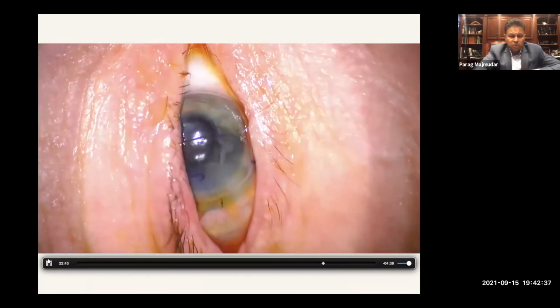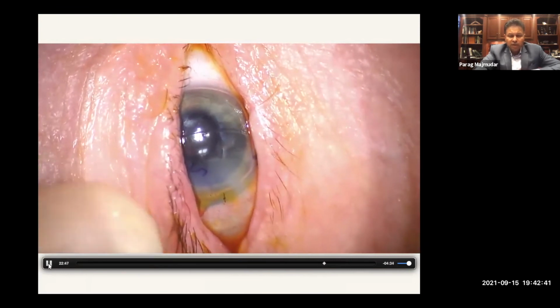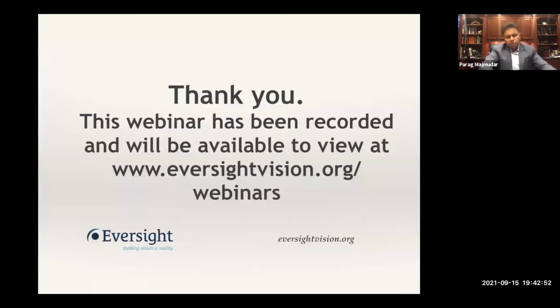Triple procedure, and refractive surprises can be a thing of the past if you pay attention to all of these different things that we've talked about, and all these little steps and tips and pearls and pitfalls throughout the process. So I'd like to open up here now for questions.